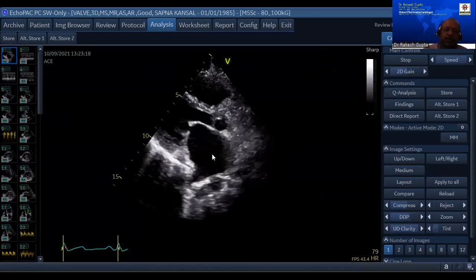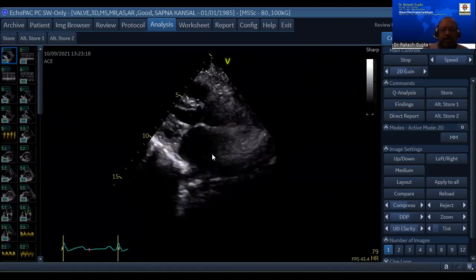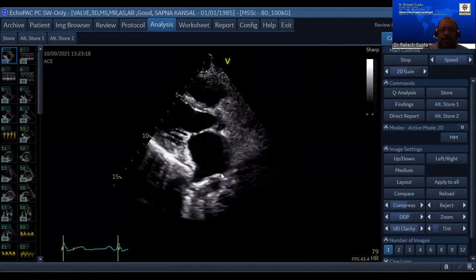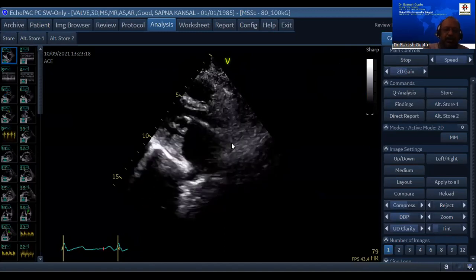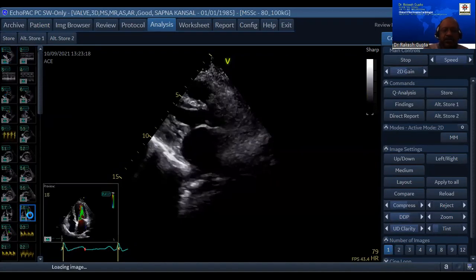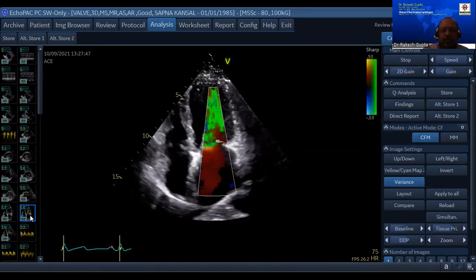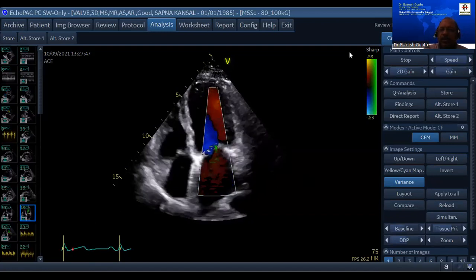All right. We have said so many things in one go. What we look for in mitral regurgitation is, as he said, we always look for LA dilatation. LA dilatation could be because of mitral stenosis, it could be mitral regurgitation. Then second, what we look for in mitral regurgitation is, go to the four-chamber view. We look at what?